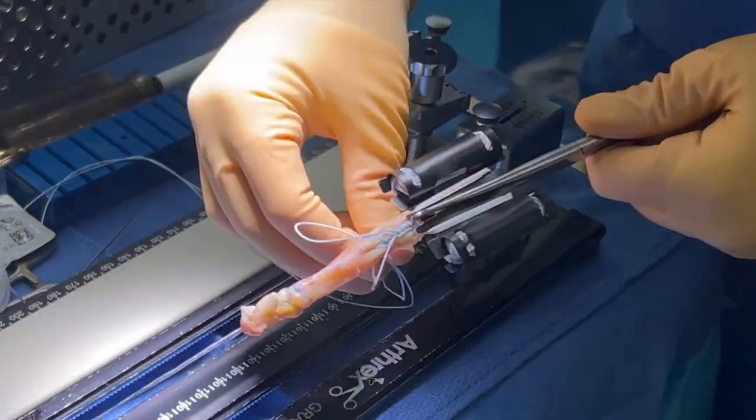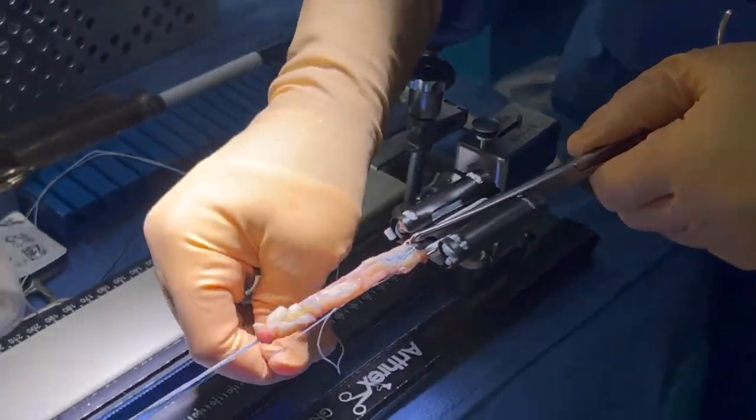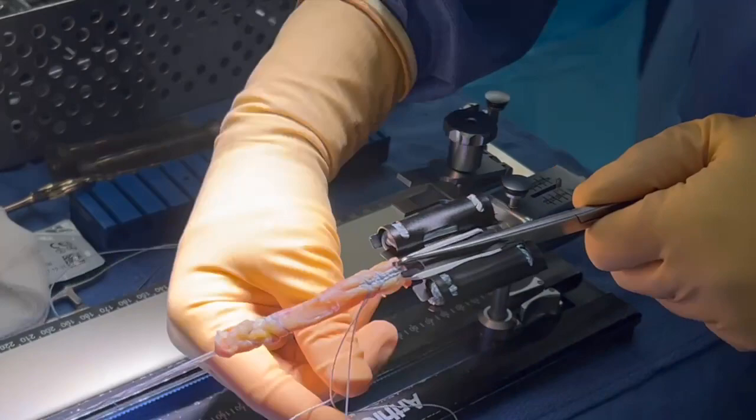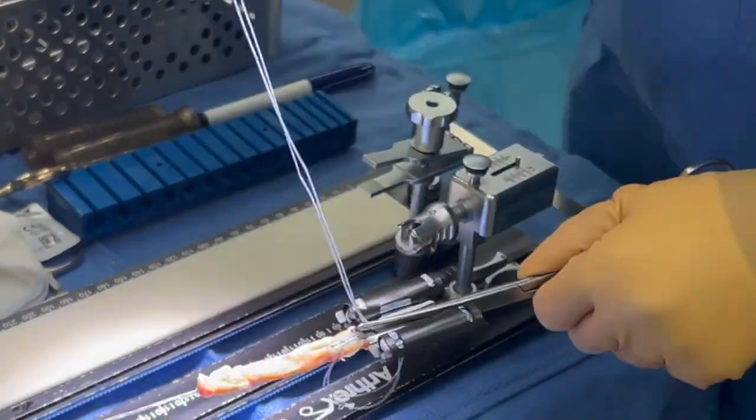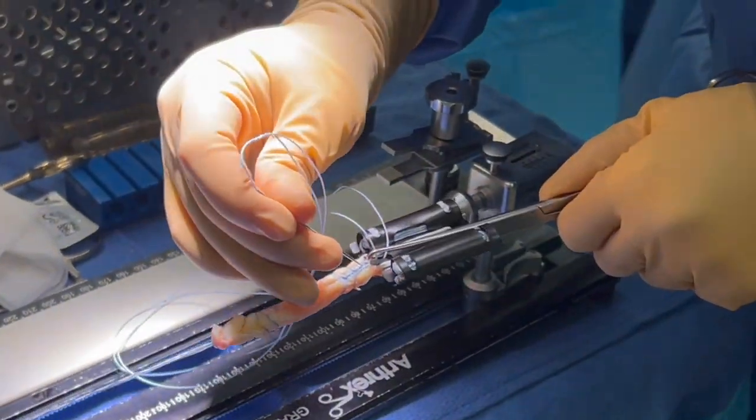This is using the newer Tightrope 2, the upgraded version. You can see we want to make sure that it's flush each time we're passing through. Then we pass through the center of the device.